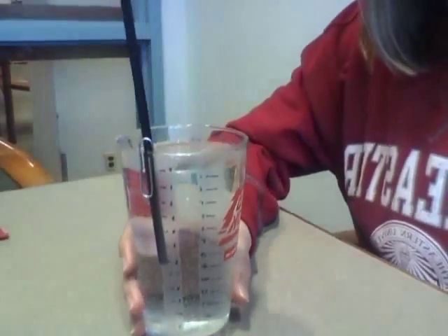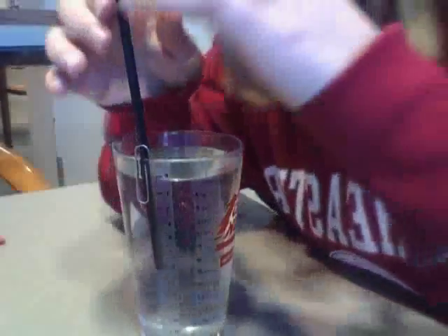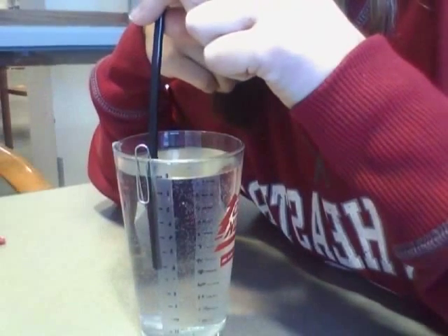Now Gina will demonstrate. As you can see, I was able to generate 10 centimeters of H2O pressure.